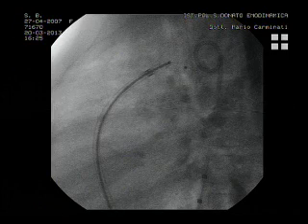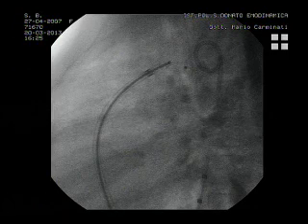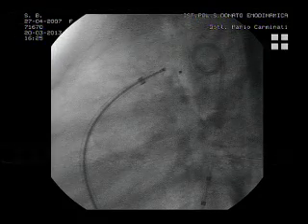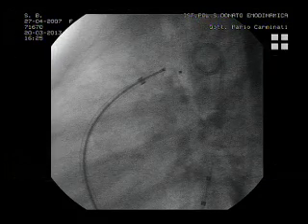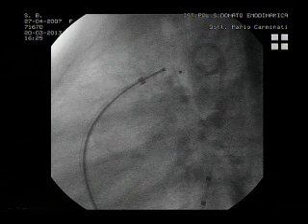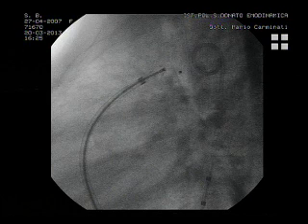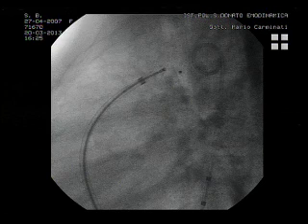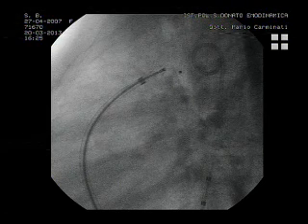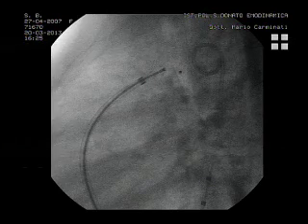It looks in the right position, but there's a lot of flow around it as well. So it's because it hasn't caused that flaring. Yeah, but what would you suggest? Release the device or do something else? Well, I would be uncomfortable about releasing this at the moment. I agree. So what would you do? So either you redo this, or... John Bass has another question. John? Or upsize. Excuse me, Jack. Upsize.